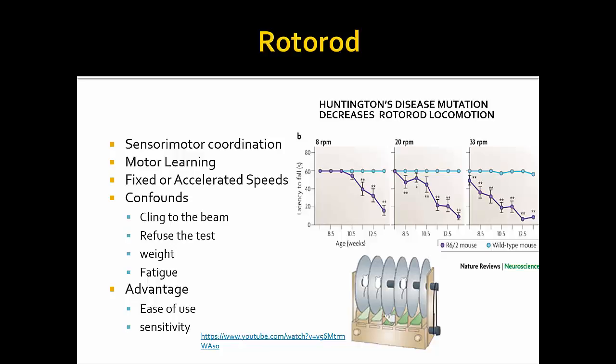And so this looks at motor coordination. There's also some learning involved in it. You'd also want to do a pre-baseline to see if your animals are able to do this. Some don't even just hold on; they just fall right off.